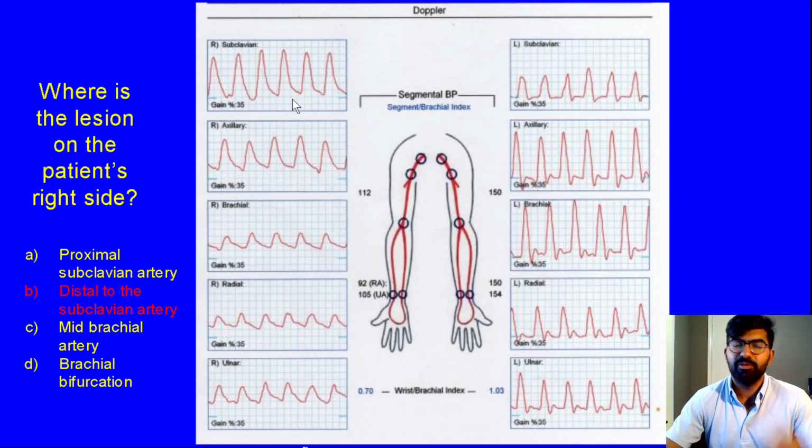And this is something I really want to get people honed in on, because quite often someone will listen to this and they'll say, oh, it's a biphasic waveform. There must be something proximal to this lesion. But in fact, it is a normal finding in a patient with this disease pathology. Okay.